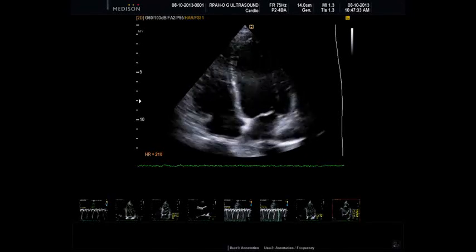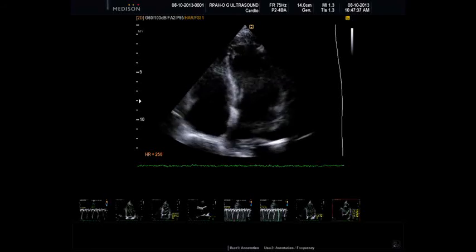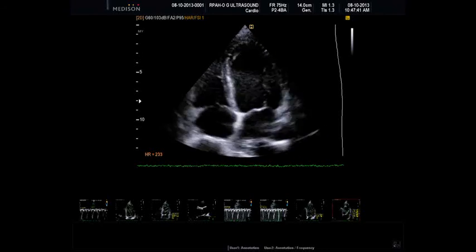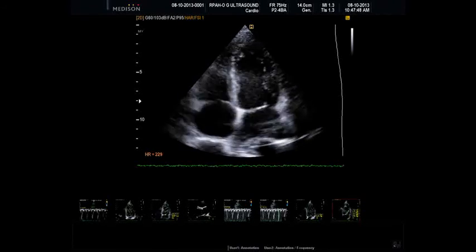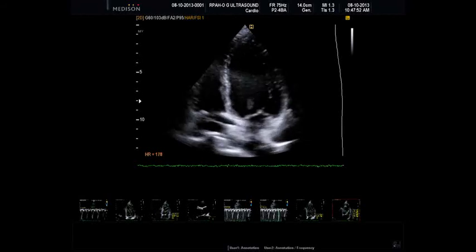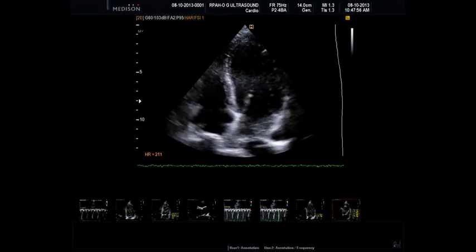Well, I think everybody's been quite impressed, and I think we thank you very much for this. I do have a question, actually. Could you just do this tracking of the volume of the ventricle again? The Simpson's calculation. Yeah.